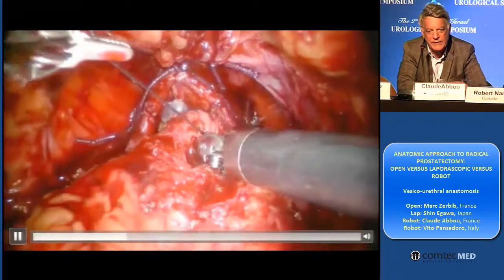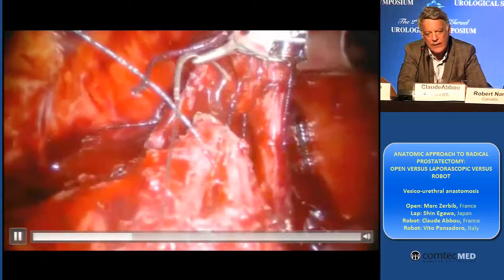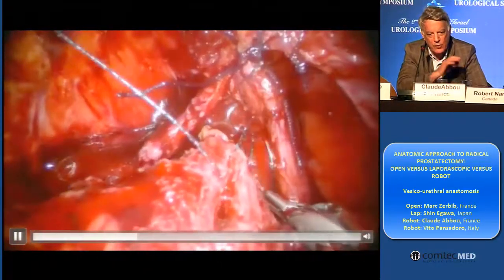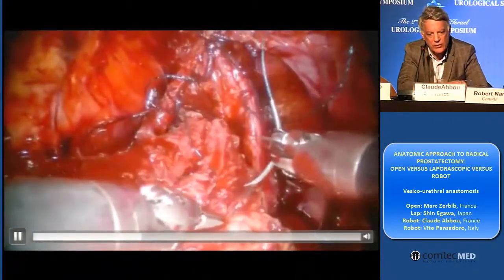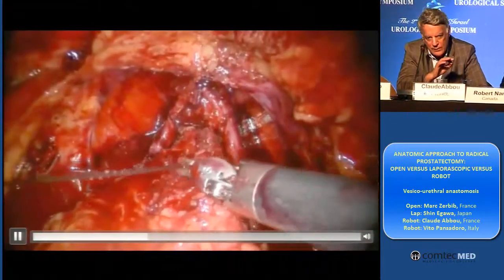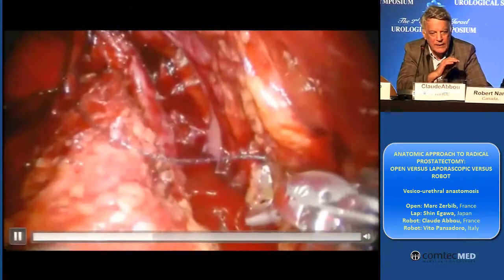If you do four passages, less stricture. You have to do many, many passages. I think I am doing usually around ten passages. It's small stitches, allowing there to be no stricture. And after that, the bladder catheter has to pass inside the bladder without any problems.